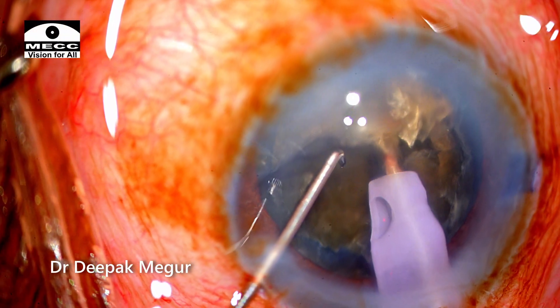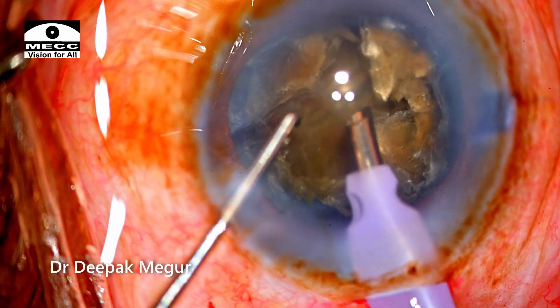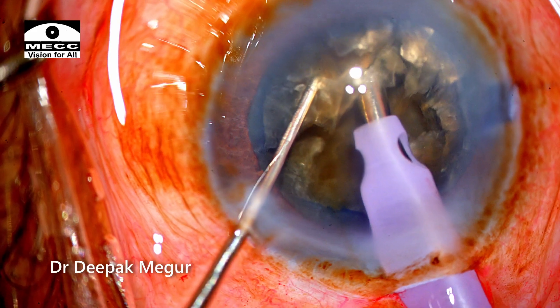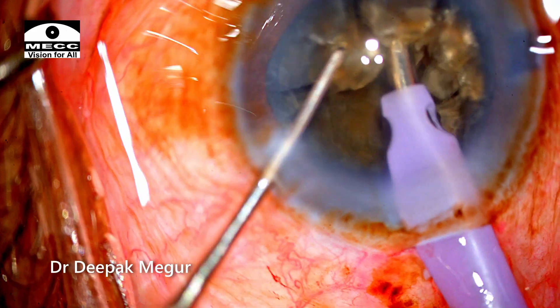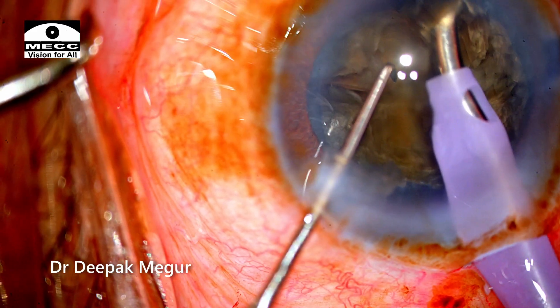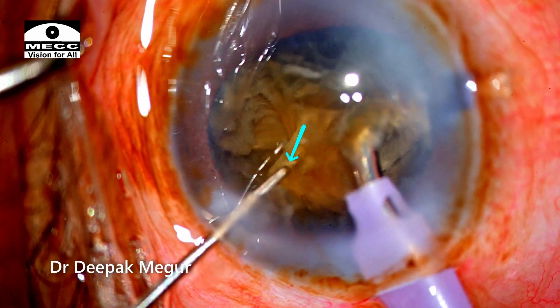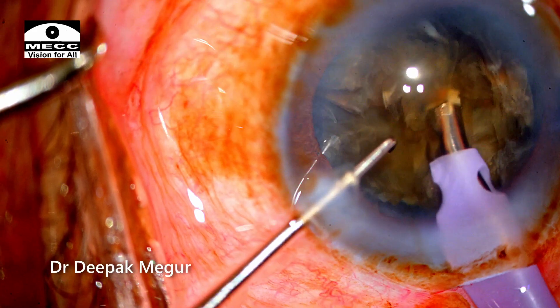The chopping maneuver is being continued. The nucleus is so bulky and dense there is a lack of space, and although the chopping is giving me superficial chunks of nucleus, the posterior plate is still remaining attached. At this point I go in with my chopper behind the fragment to cut some of the adhesions holding the posterior plate — this is one way of dealing with the posterior attachments.